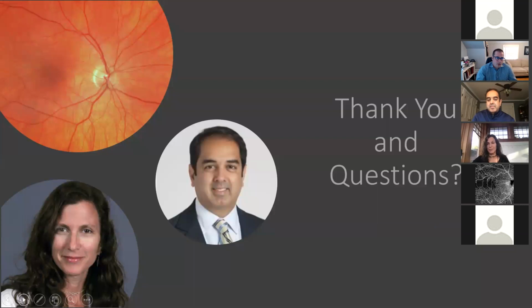So a question here from Dr. Eichenbaum is, will SSOCT change your practicality of usage of OCTA? Is SSOCT, swept source OCT, changing your utility of OCTA? Well, I think the real benefit that I notice is the wide field view that we can get with the Plex Elite. I really do find that I do the 12x12 mosaic in almost all of my diabetics and anyone with peripheral pathology, and I think it's great. It's fast, and I think there'll be utility to look at choroidal neovascularization as well.